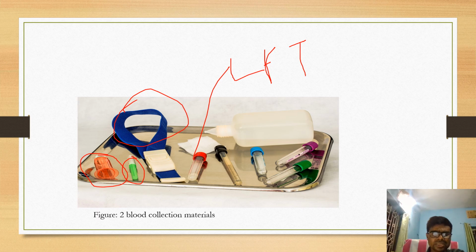This is the blue vial, blue cap vial, that is used generally for blood coagulation. This is the purple vial that is generally used for the collection of all the hematological tests like CBC, platelets, TC, DC, hemoglobin, packed cell volume, HCT, hematocrit volume. These are the tests which come under hematological tests. And this is the green or heparin vial that is generally used for the heparin test. And as you see, this is the black vial. This is especially for special tests, a vial that is not used for the general test. Okay, so move to the next slide.